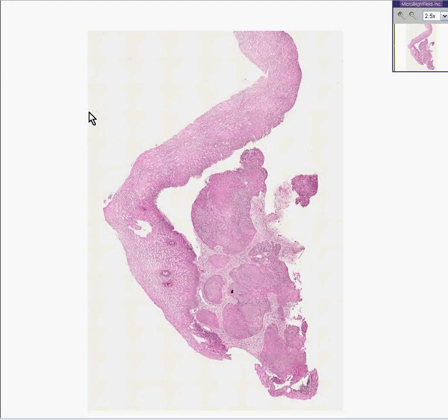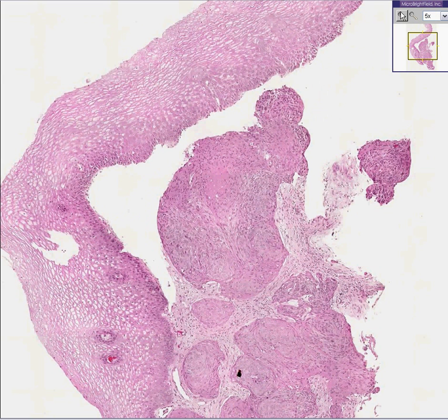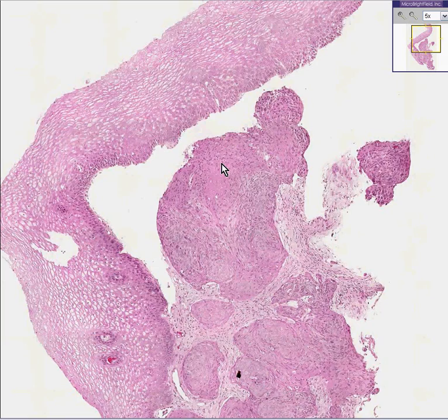This slide, or this case, is entitled Cervix Squamous Cell Carcinoma, but let's not believe it. Let's figure it out for ourselves. In fact, let's see if maybe the book is wrong.